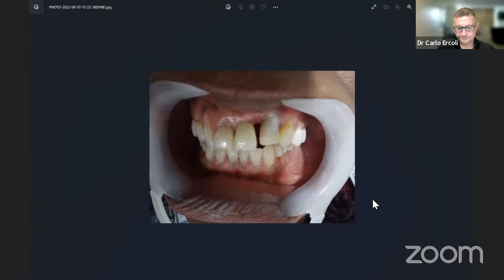Sure. Well, of course, if those two teeth are implants, you're having a challenging situation. Not only because I will guess that the position of the implants and the bone availability is further apical, but also because it appears to me that you have some recession on the tooth 2-3 as well as on 1-1. So that tells me that when you have a recession, generally you have a thin buccal bone, you have a challenging periodontal situation that might need a composite approach to be dealt with.